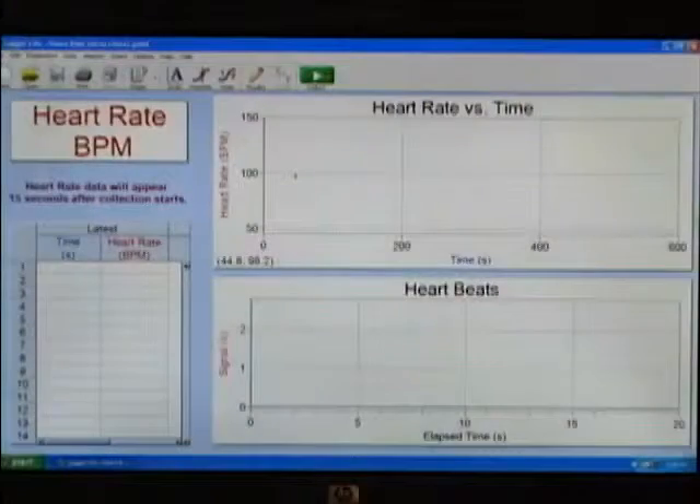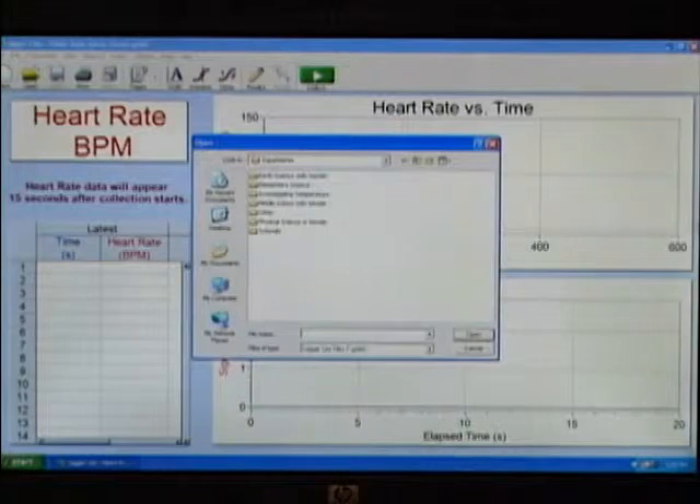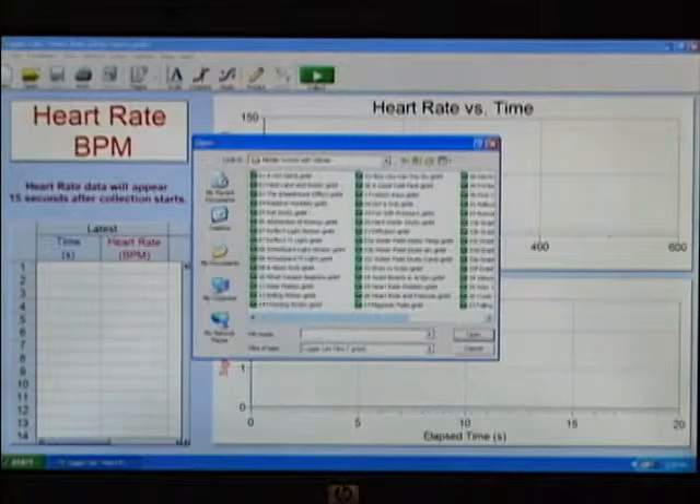This is the Auto-ID screen on LoggerLite when we've plugged in the heart rate monitor. For this particular lab, as with all of our labs from the books, we have an experiment file prepared for you. I'm going to get to that by going to the Open button in the toolbar, clicking Open, and then choosing the Middle School with Vernier folder. Inside that folder are all the labs from that book, and I'm going to choose number 25, heart rate position.